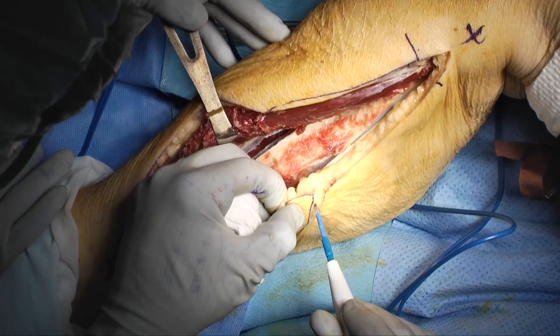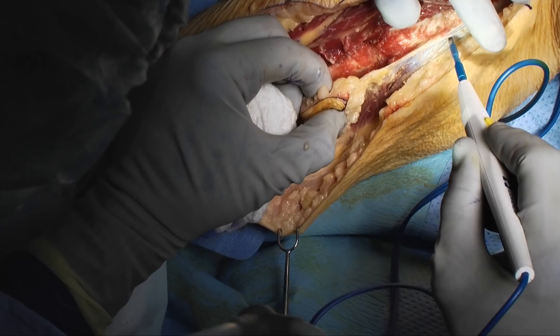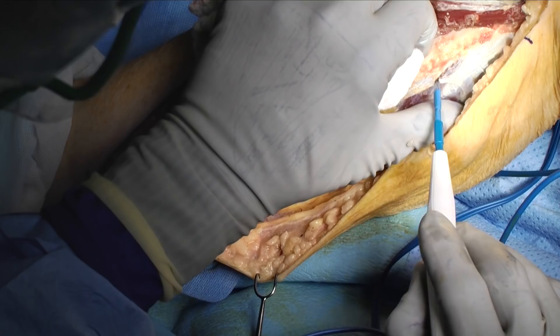After incising the interosseous membrane, we island the skin paddle by making a posterior incision through the skin. This skin elevation continues posteriorly back to the level of the saphenous vein and sural nerve, and then dissection is carried forth the entire length of the fibula to elevate the posterior musculature off the fibula. At this point, the skin paddle becomes islanded just on the perforators and the septum. If there are no interseptal perforators, they are coming through the muscle, and a small cuff of flexor hallucis longus muscle should be harvested.